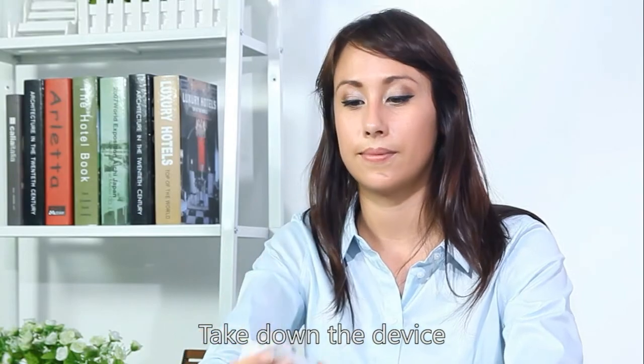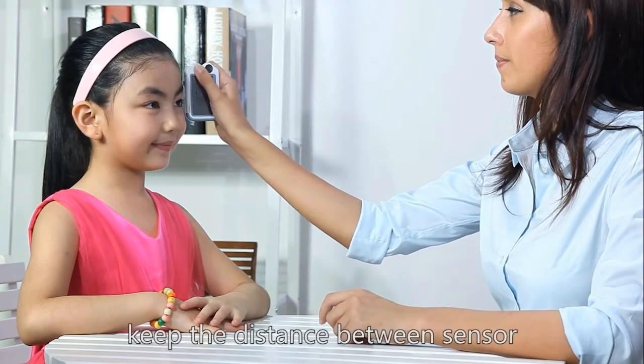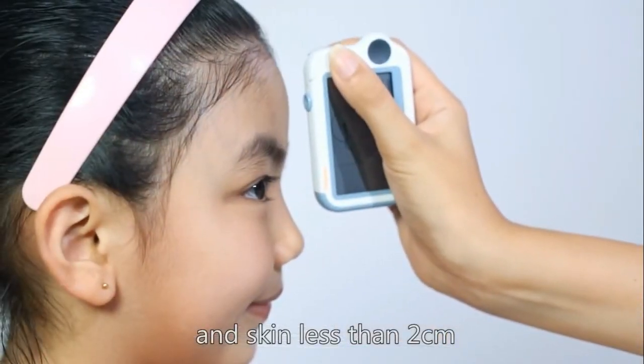Take down the device and the screen will show the measurement result. During the test, keep the distance between the sensor and skin less than two centimeters.